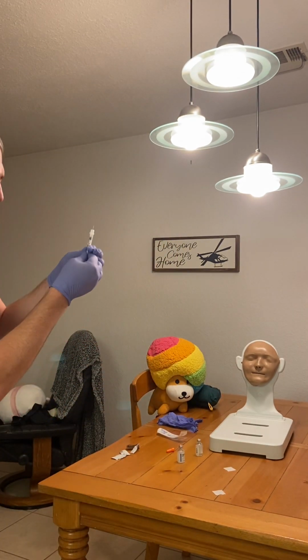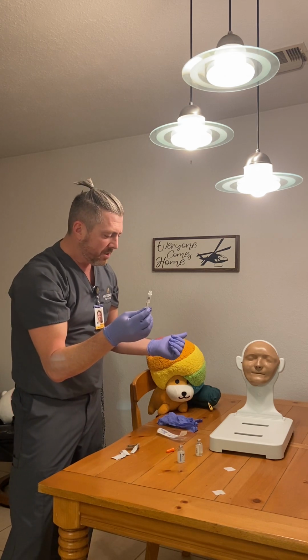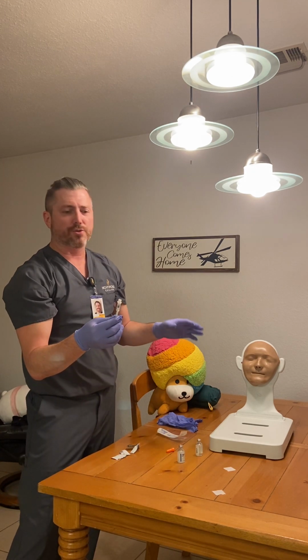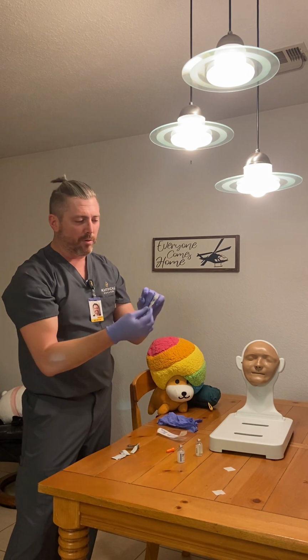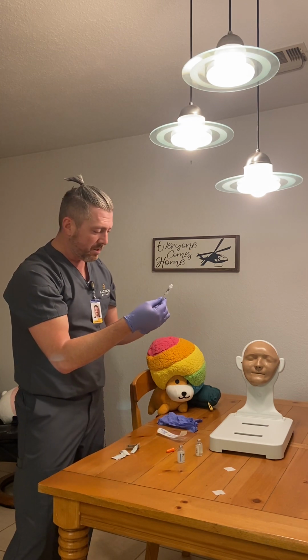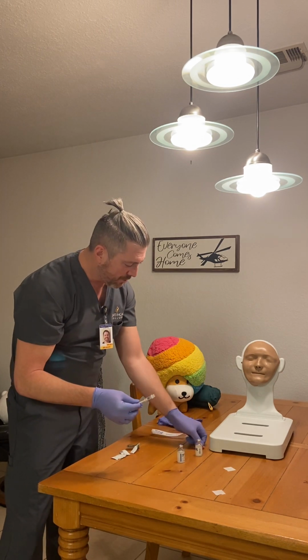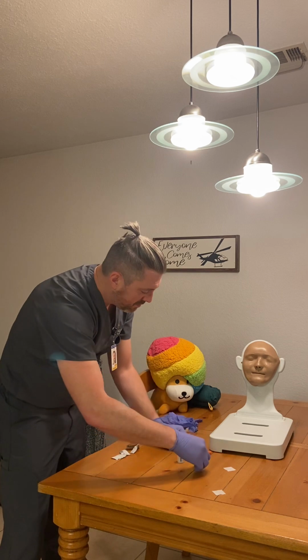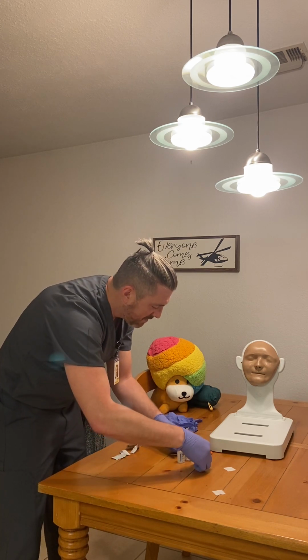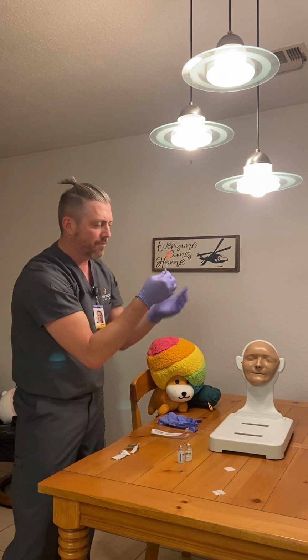All right. And voila, that is how we do the medication administration. If we did this out of the patient's room, I would put a label on this with the patient's name and the medication and the dose. We did it at the bedside, so I'd be ready to give the injection now. I'm just going to recap my needle. Oh, it's moving. And voila, we are done.